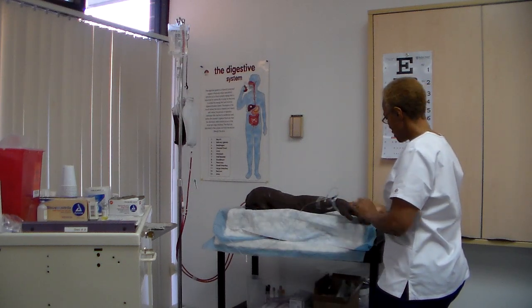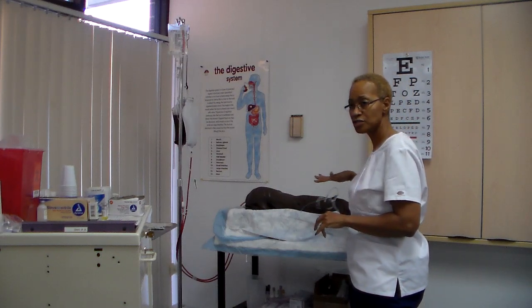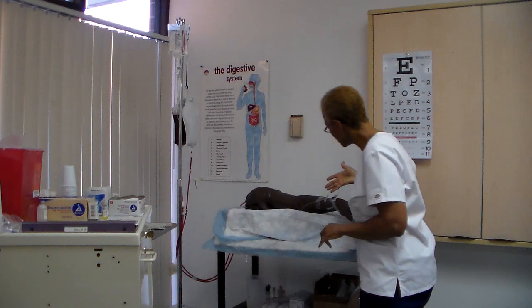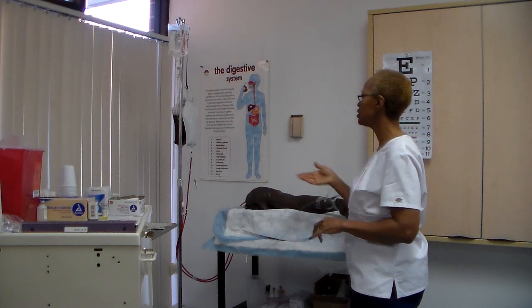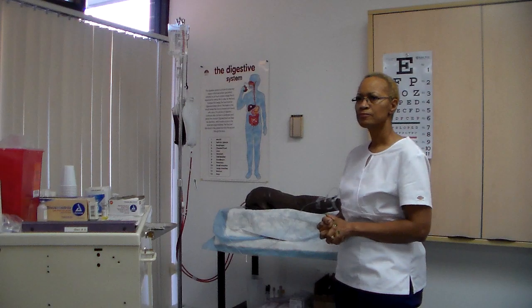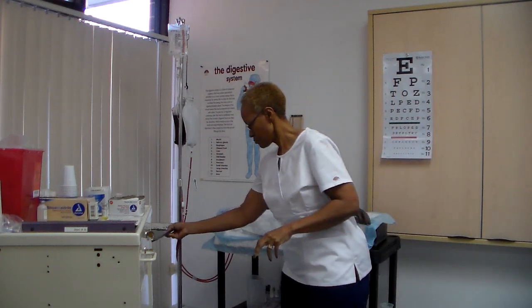Anytime you're starting an IV or you're adding to an IV, you're going to ask your client, is it burning? Do you have any sensation at the site? You're going to observe the site. You're going to look for any redness, any swelling. You're going to make sure that they're not having any complaint. It looks good. Your flow is going. Okay? Observe for signs and symptoms of fluid volume excess. Okay. Periodically return to client's room to assess IV insertion site and rate of infusion.